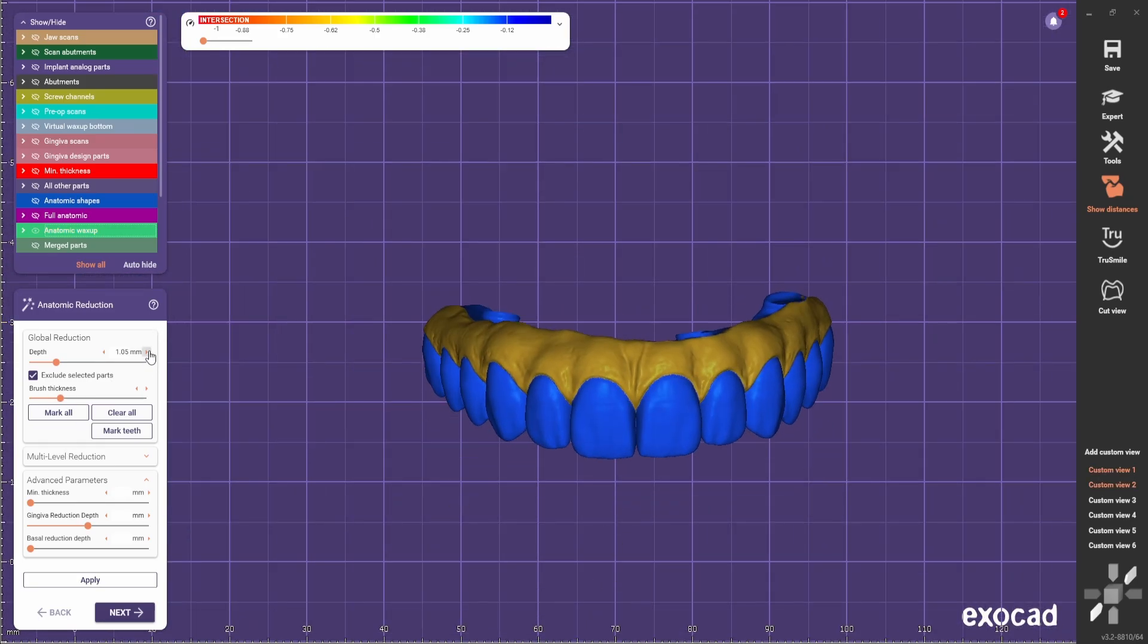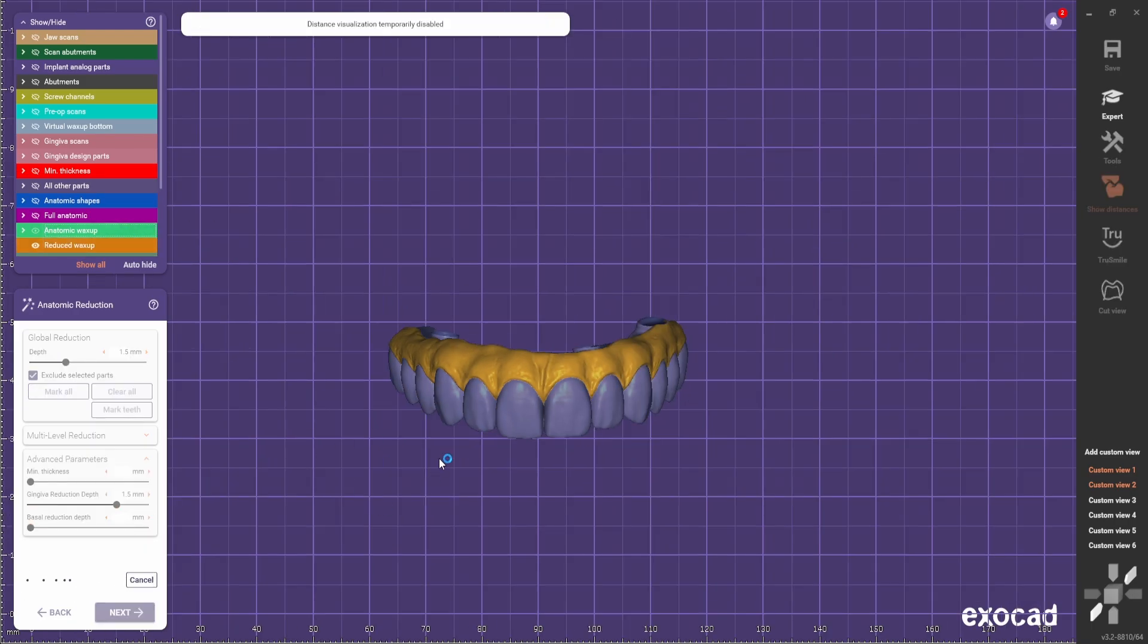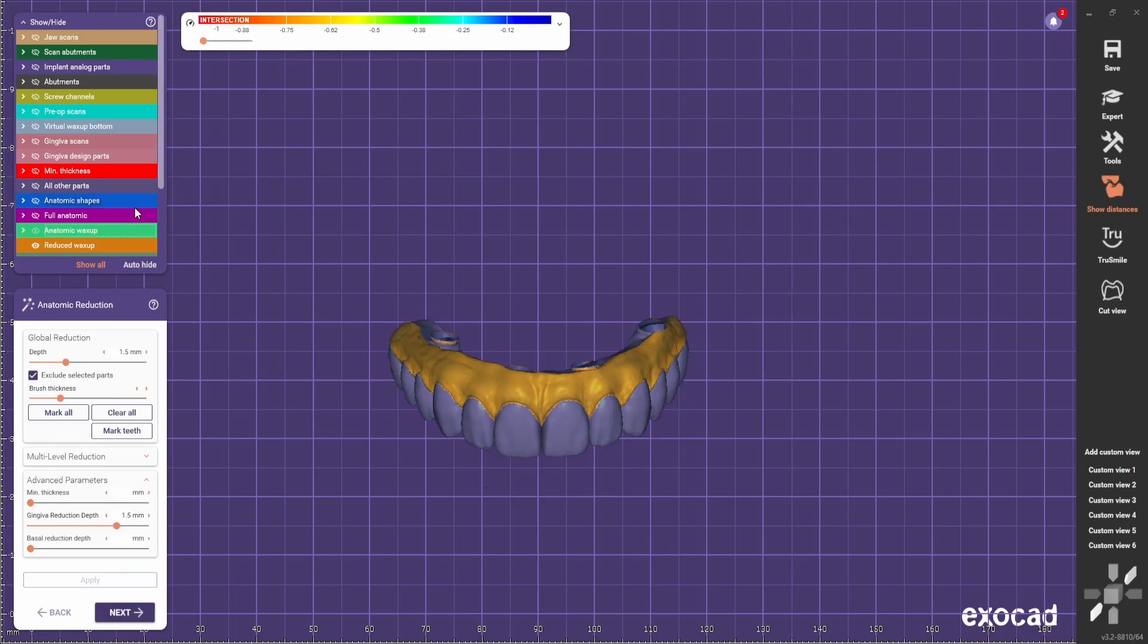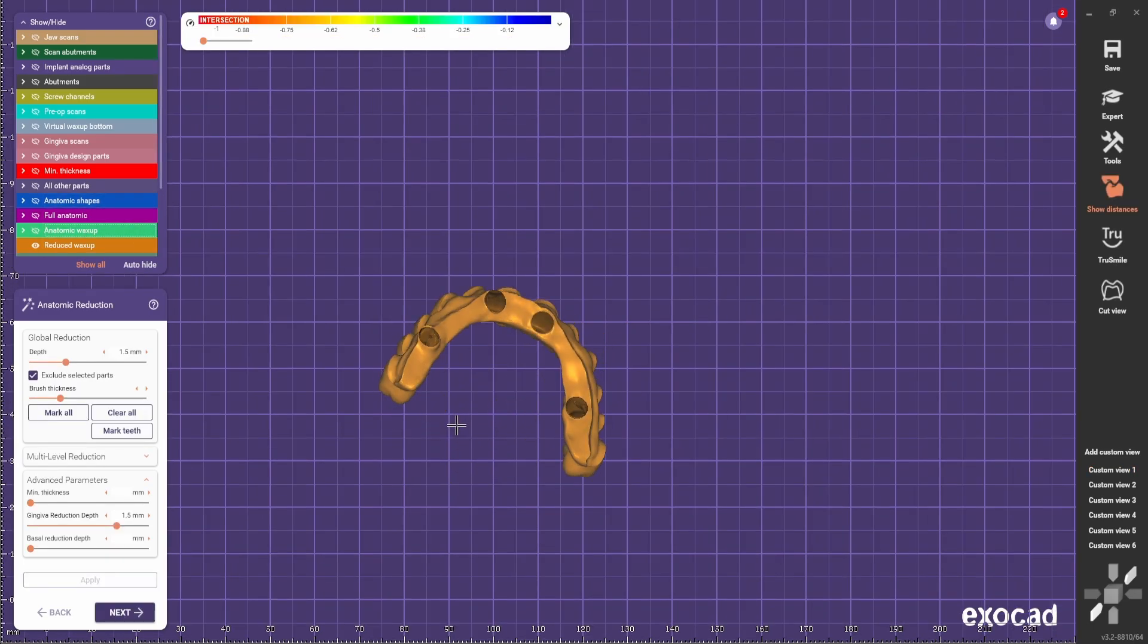Reduce 1.5. Make sure that the gingiva reduction depth is the same as this value and click apply. The reduction is done.